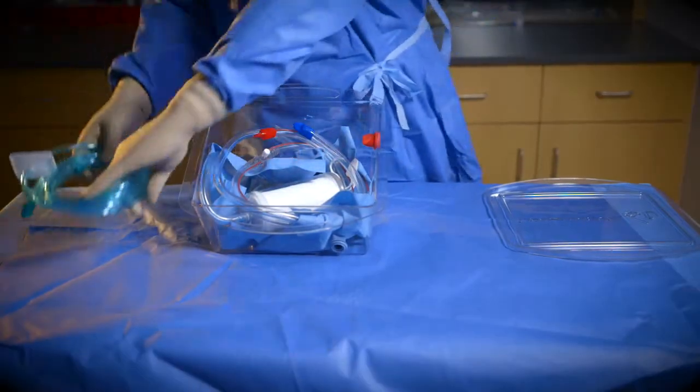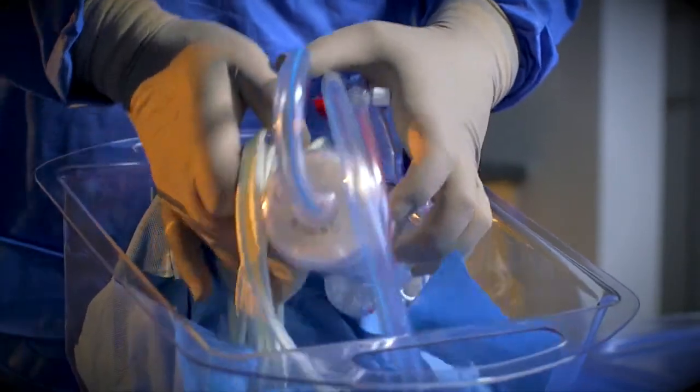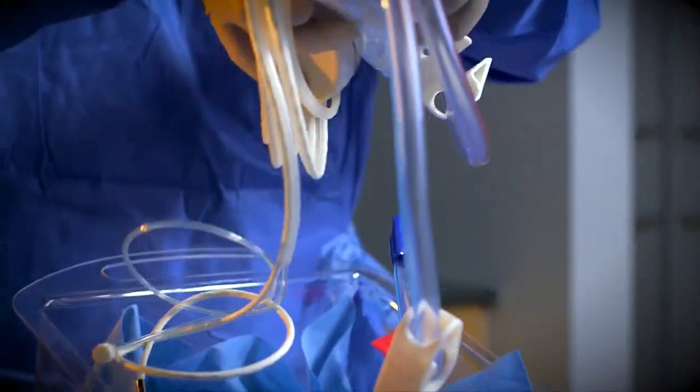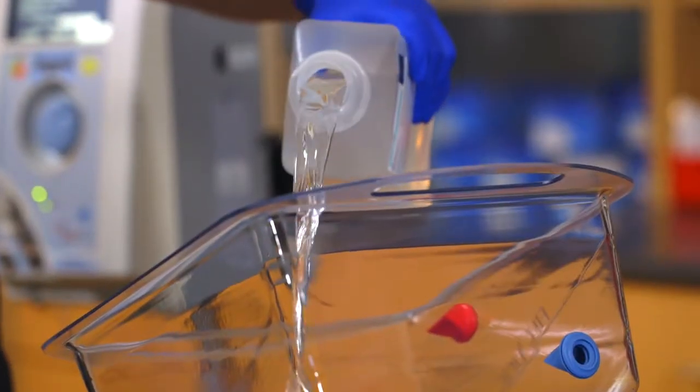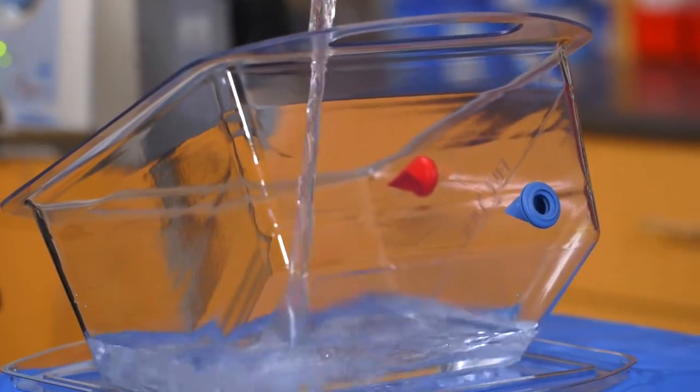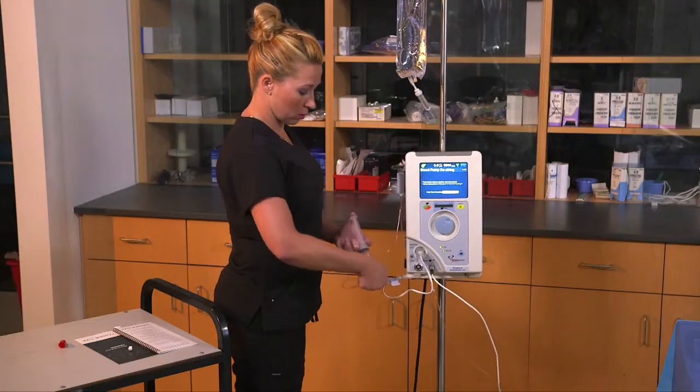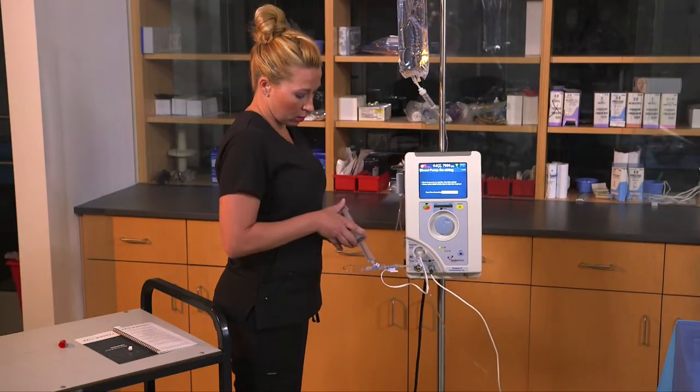The priming basin was designed to provide customers with a quick and repeatable priming process. The controller operator fills the basin with 4000 cc's of saline. Infusate priming is performed to prime the lower housing.